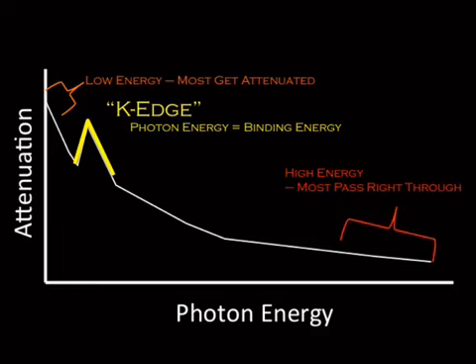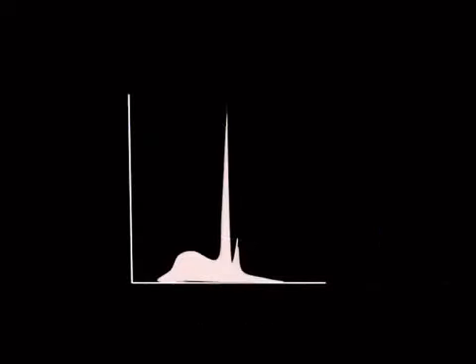Now, the benefit of removing the low energy photons is that they are contributing only to dose, and they're not helping with image contrast. Okay, so here we go. Here's our regular moly spectrum, and we'll place our filter across it with that spike of a K-edge here.